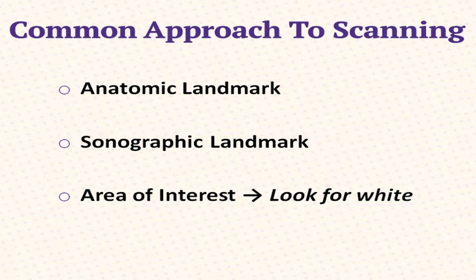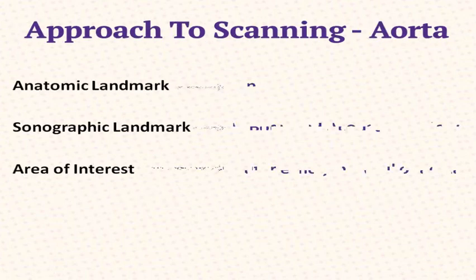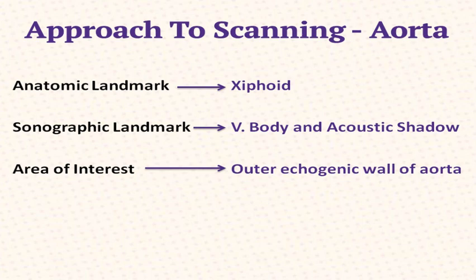When we apply this approach to the bedside aortic study, the anatomic landmark is the xiphoid, the sonographic landmark, the vertebral body and its acoustic shadow, and of course the area of interest is the aorta, but most specifically the white outer echogenic wall of the aorta.